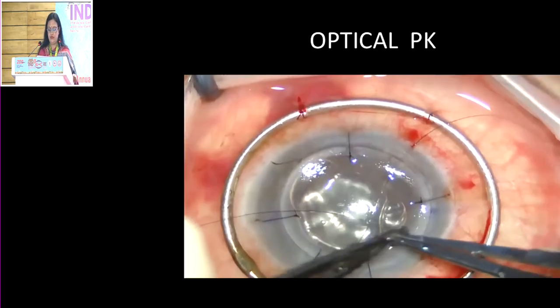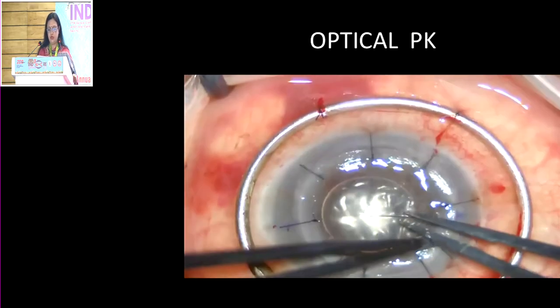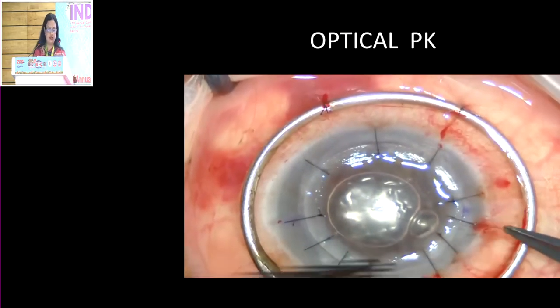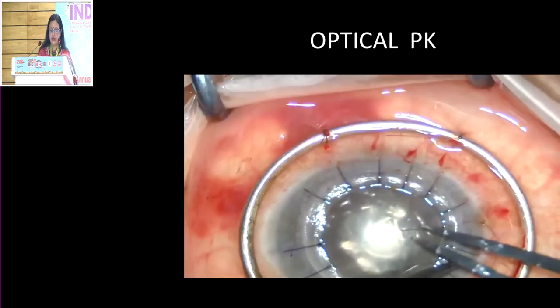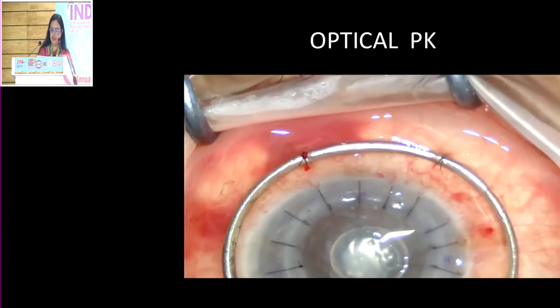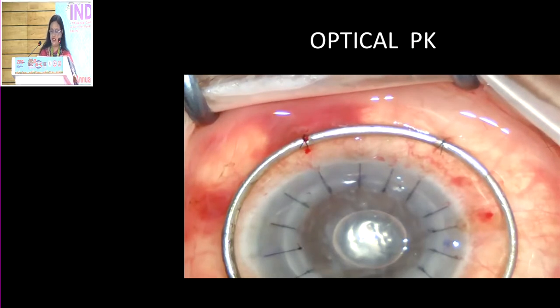You put four interrupted sutures, then in between add another four, and go on multiplying like that until you get around 16 sutures. 16 interrupted sutures are placed. I normally bury the suture towards the donor site because that prevents the knot from being closer to the limbus, which can attract blood vessels and increase the chance of rejection.